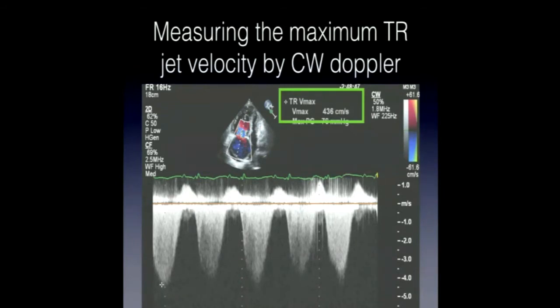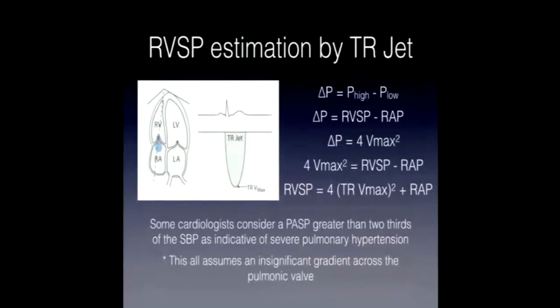So basically we've gotten 4 meters per second as our tricuspid jet velocity. And what was the equation, Paula? Simplified, yeah. Anyway, so 4v squared. So the pressure change is 4v squared. So we could put it in here.